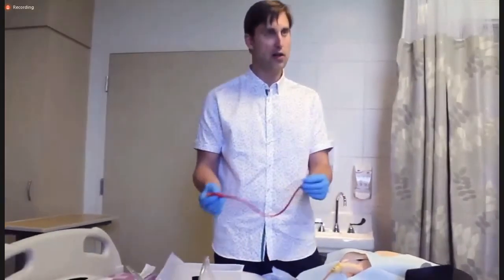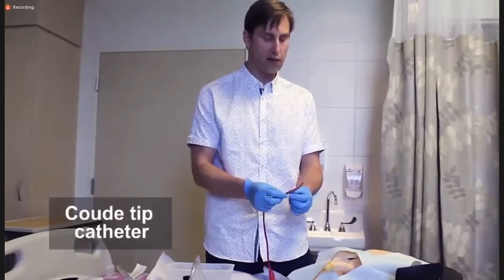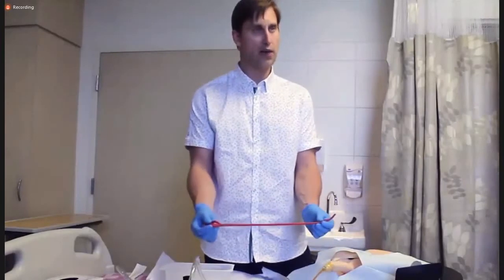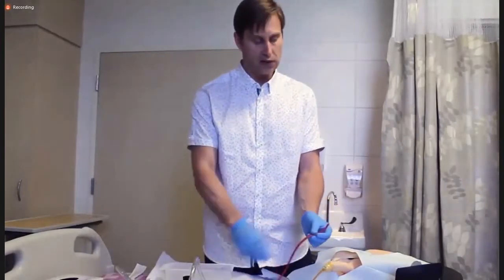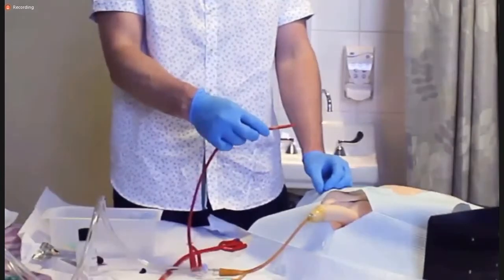Now in some instances you can encounter difficulties placing this catheter because of the angle of the urethra at the junction of the anterior and posterior urethra. So there is something called a coude tip catheter. And a coude tip catheter, simply put, is identical to a regular Foley catheter except for one key difference, and that key difference is a curve.